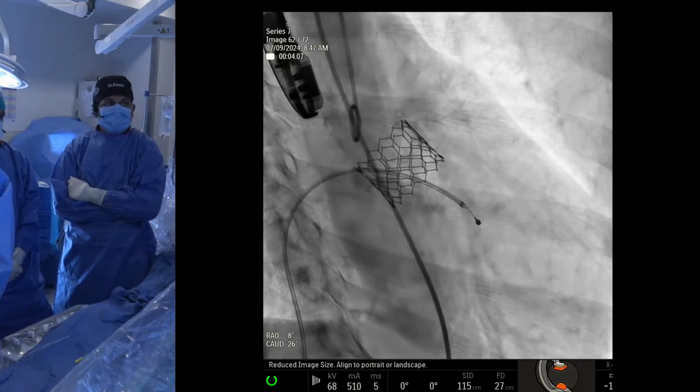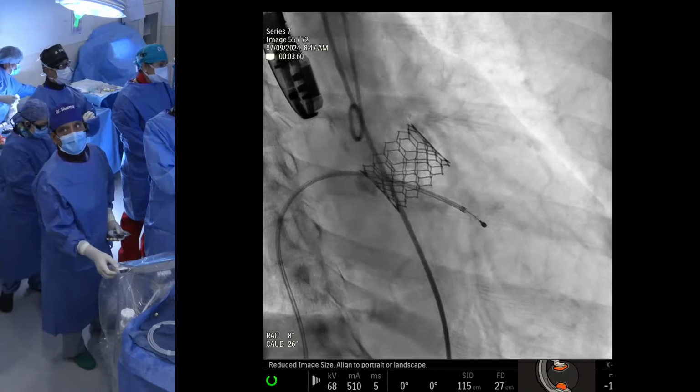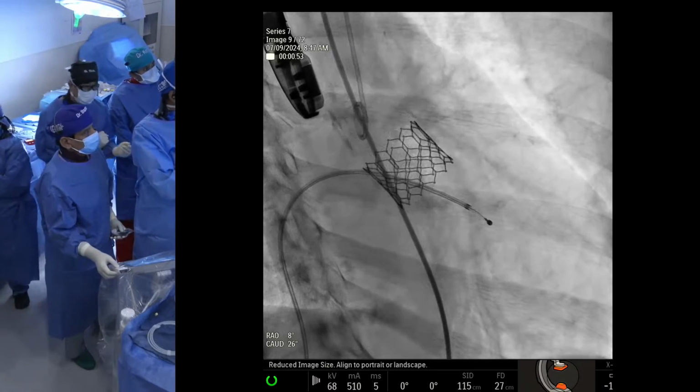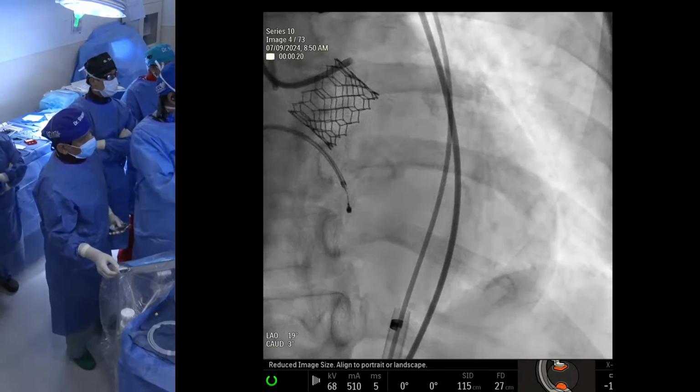at the bottom of the honeycomb, which is the outflow, which is the clear part, because the rest of it has the SAPIEN-3 Ultra, which already has the sealing skirt. And you can see the aortogram here. Obviously, severe PVL. You can see that in the other aortogram as well.